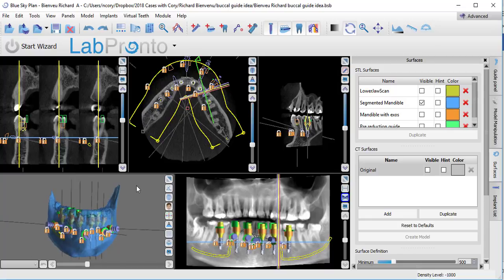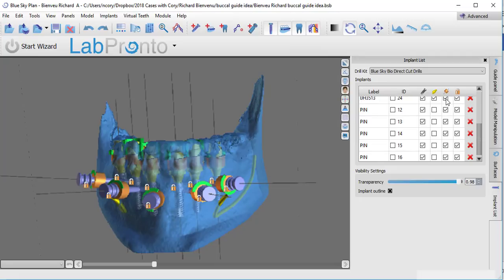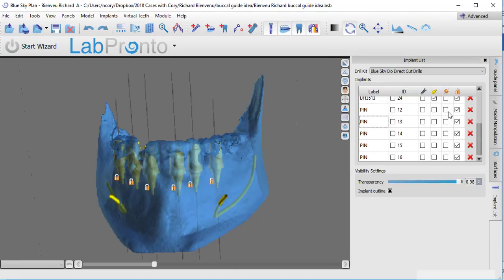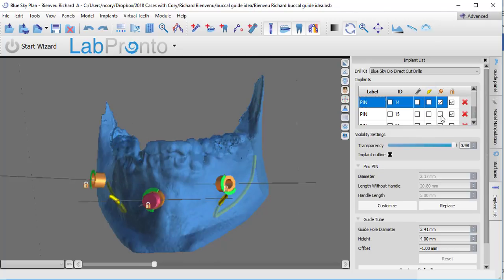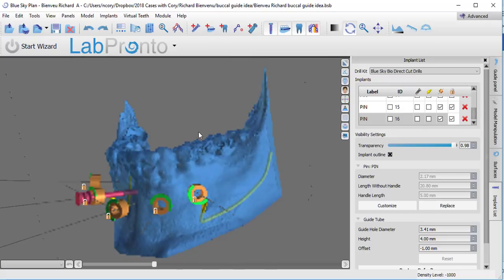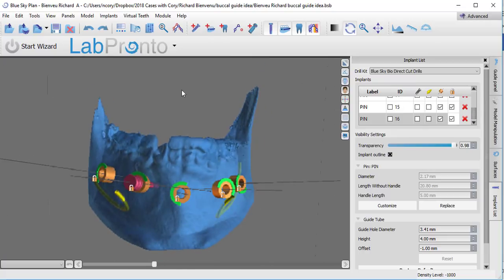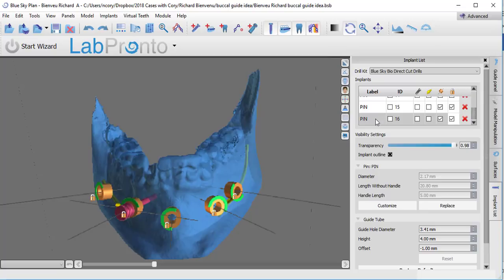In this particular video, I'm going to show how to do this entire process solely in Blue Sky Plan, and then I'll follow up with another video showing how you can add in Meshmixer for an alternative workflow. So we've segmented the mandible, and what we're going to do, just big picture, is turn off all of these implants and guide tubes except for the pins. We want the pins on because we want our bone reduction guide to be able to pin in place. We do not want the implant tubes on just yet. The starting point is that we're just going to make a surgical guide over the top of this without any of the implant tubes on, just the guide tubes for the pins.